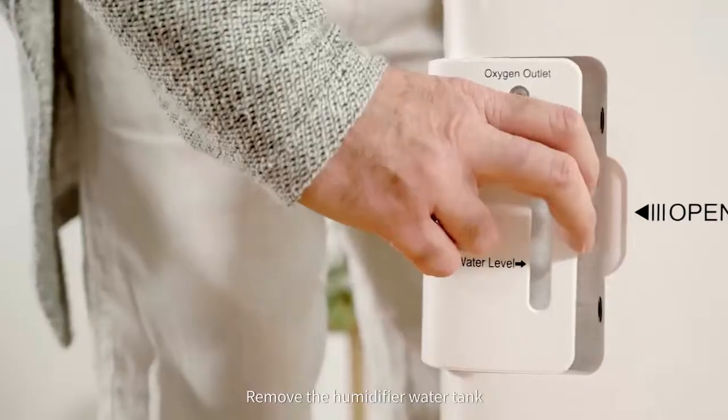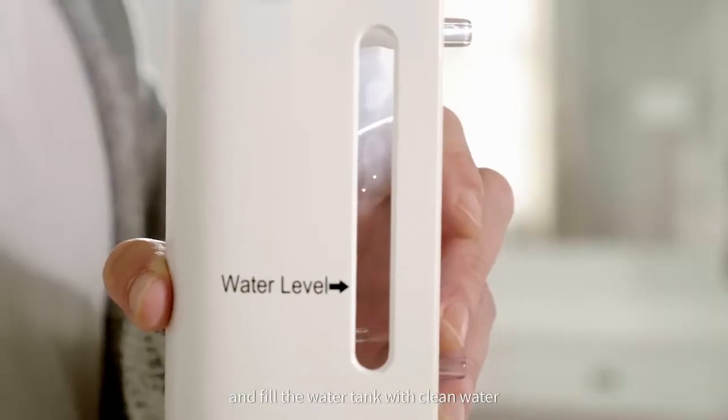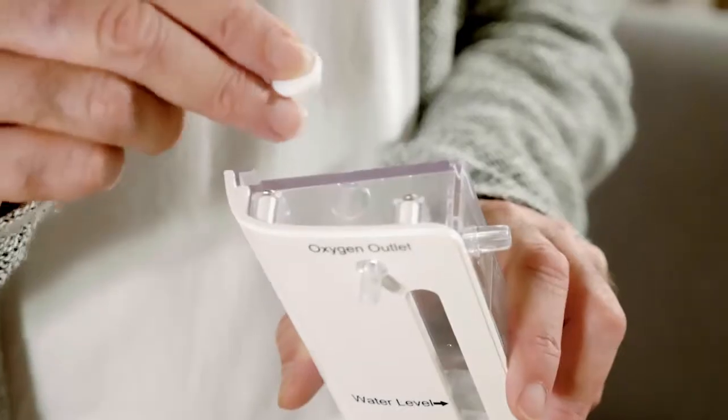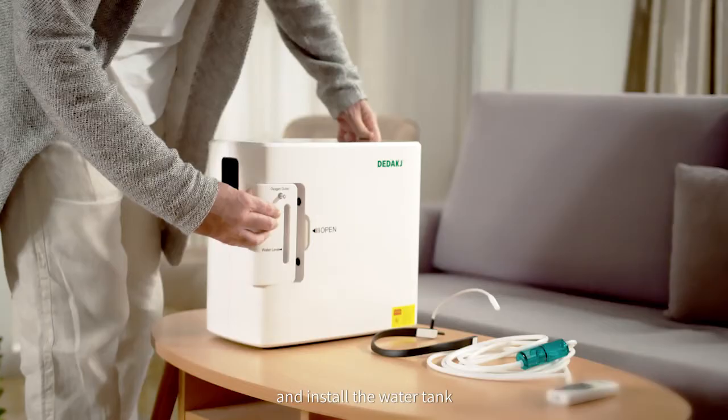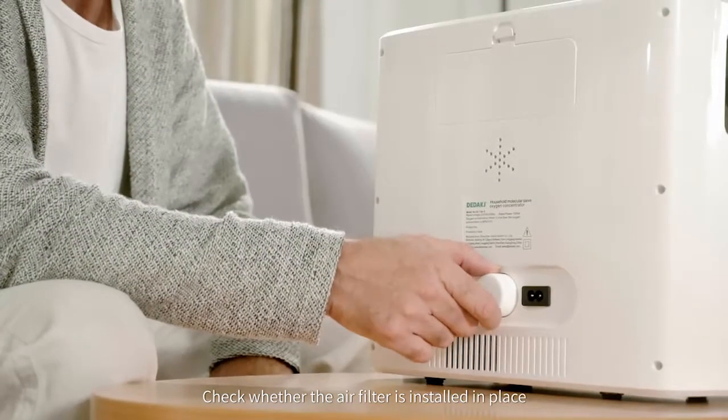Remove the humidifier water tank. Open the rubber stopper and fill the water tank with clean water, not exceeding the highest water level. Plug the rubber stopper and install the water tank.